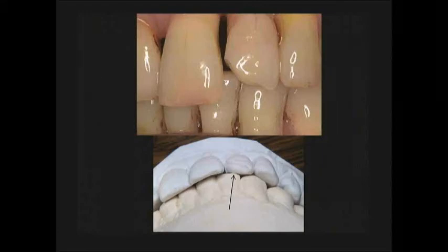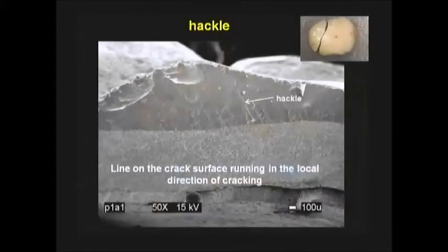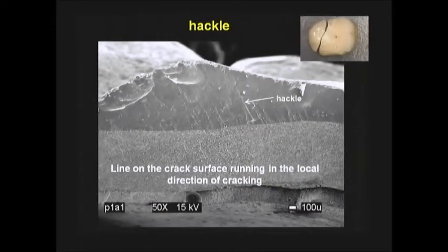Off my little veneering of my PFM. PFM breaks as well, not just all ceramic restorations. Okay, hackle. A hackle is a line on the crack surface running in the local direction of cracking. You see these lines here?